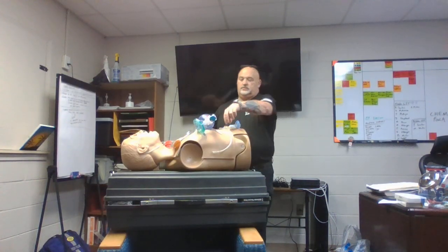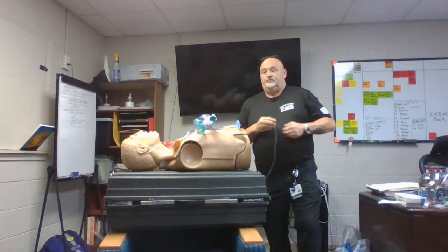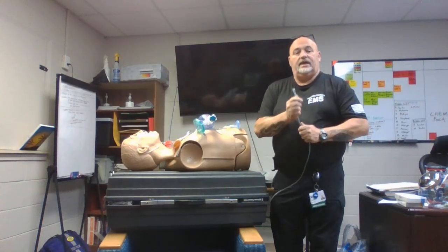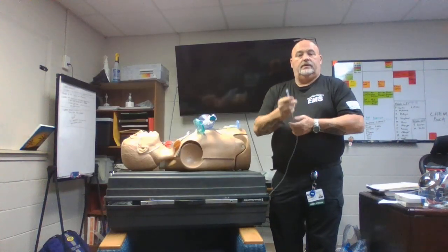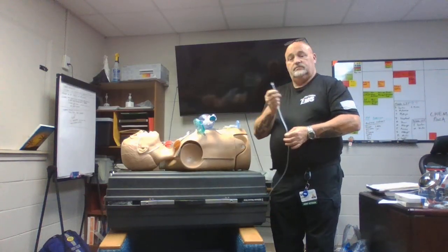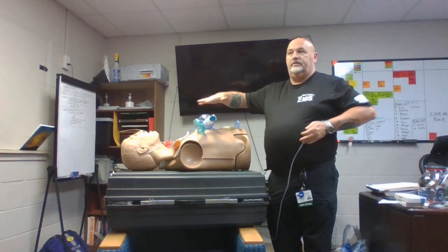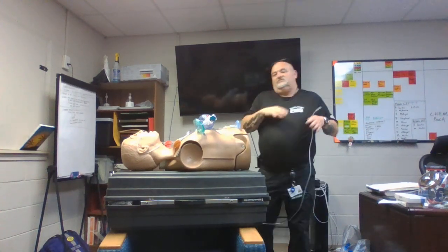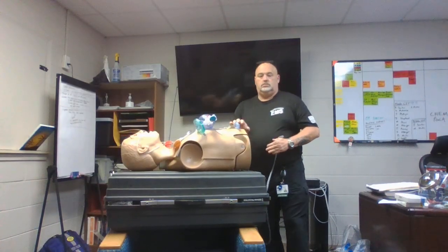But remember, the nasal cannula, it may just be for your comfort. Patient SAT may be 98%, but it's, I can't breathe, I can't breathe. If you put this on at a low flow, it's going to make them comfortable. With that being said, are you giving a lot of oxygen? No, not particularly, right? It's more for comfort.